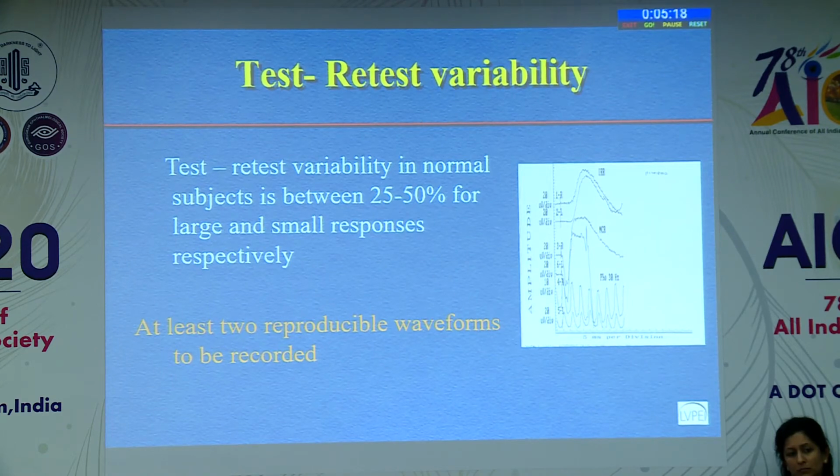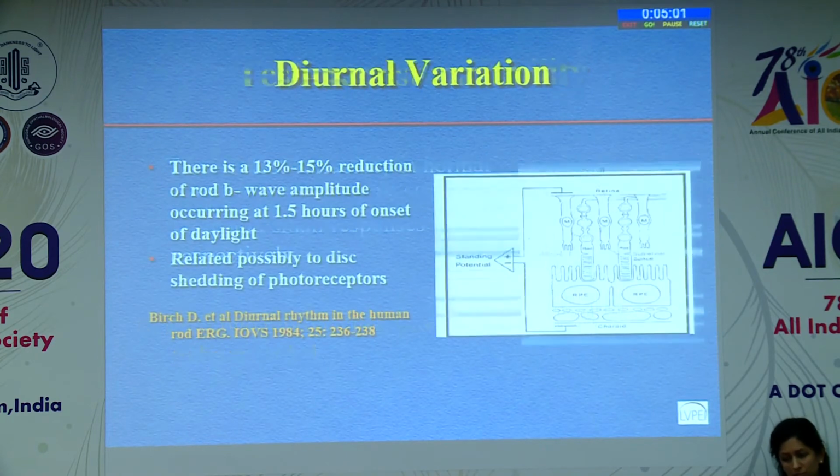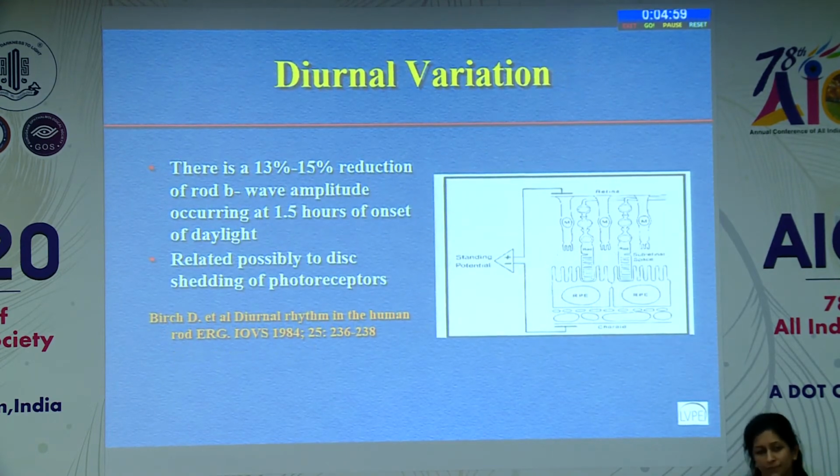The good thing about diseases is that in most of the retinal diseases, a pathological ERG is very different from a physiological difference because not only do the waveforms change, but the amplitudes and the implicit times also change quite drastically, especially in diffuse retinal dystrophies. So just a reduction of amplitude should not tell us that there is a disease or the disease has worsened.